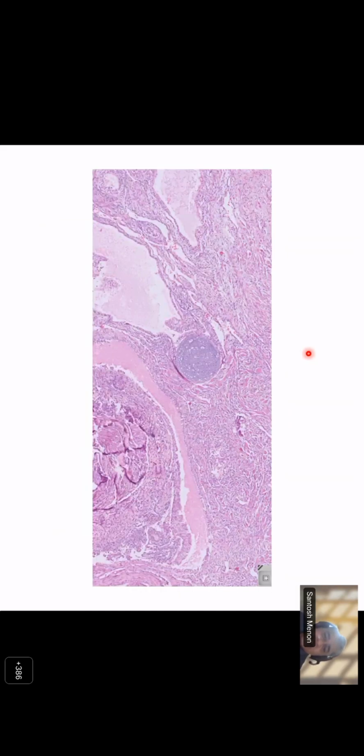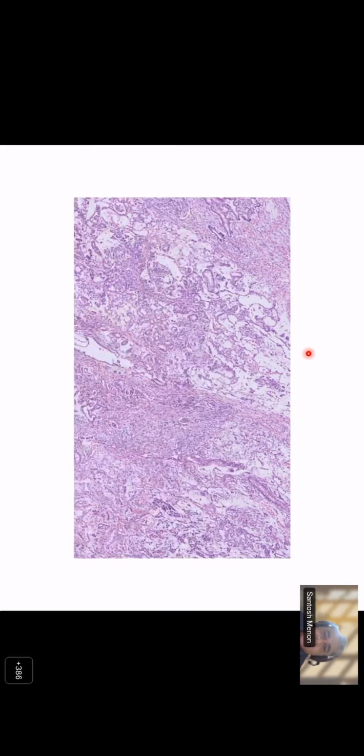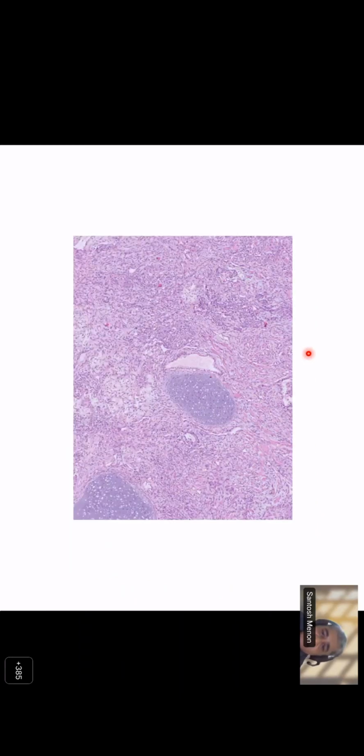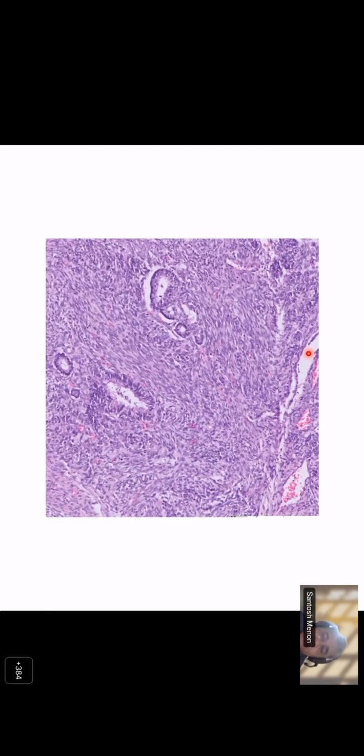A couple of pictures to show non-seminomatous changes. This is a non-seminomatous germ cell tumor showing teratomatous cartilage and epithelium. Yolk sac pattern, the typical classical microcystic pattern, or the endodermal sinus pattern. You can have rhabdomyomatous elements, which are again banal and benign looking. You may have very spindle looking stroma, which you call immature mesenchyme, which has no significance. Immature teratoma itself, with immature neuroepithelium, has also lost its significance in most of testicular pathology because they are almost always part of the NSGCT spectrum.